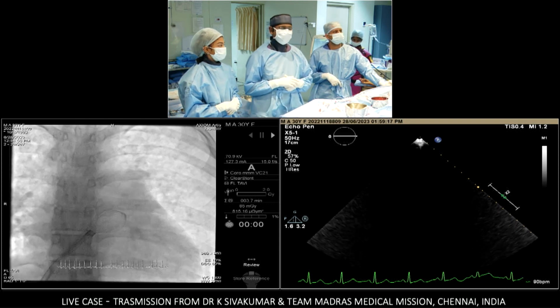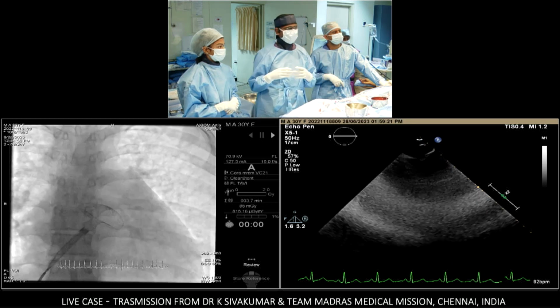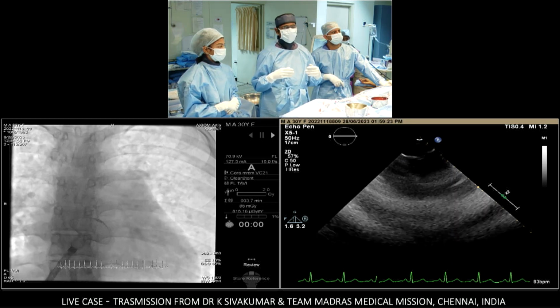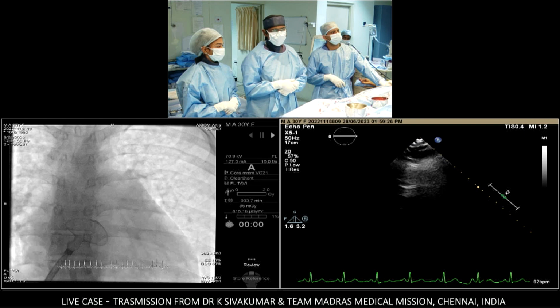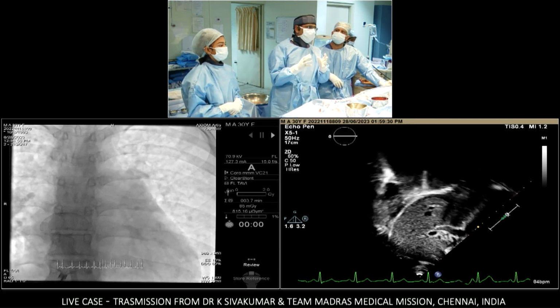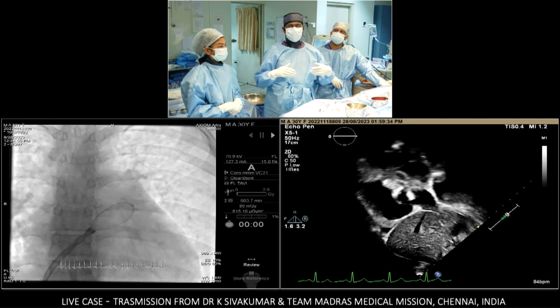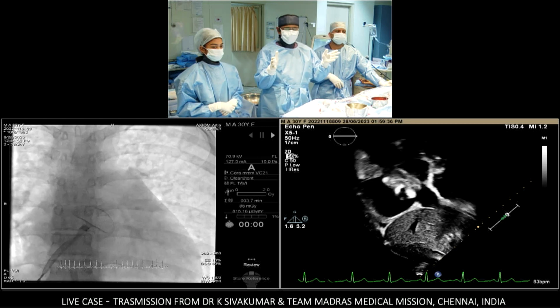I think so, Shaq. I don't think in this device we can plan it in such a way that only an 18mm disc will be engaging. We know that the nitinol's property is that the left atrial disc never fully opens until the right atrial disc itself is open, because it's still constrained.